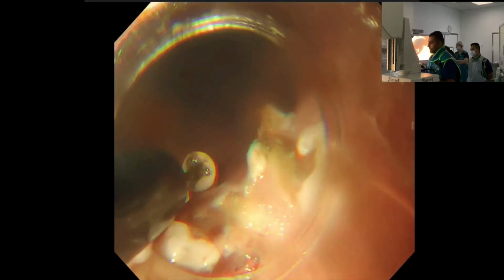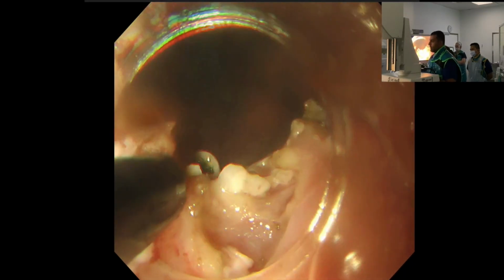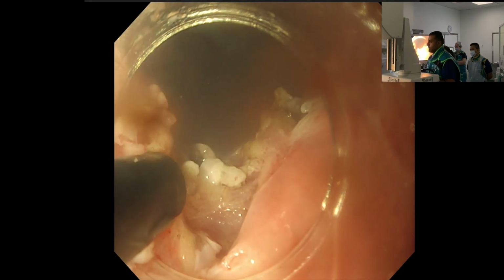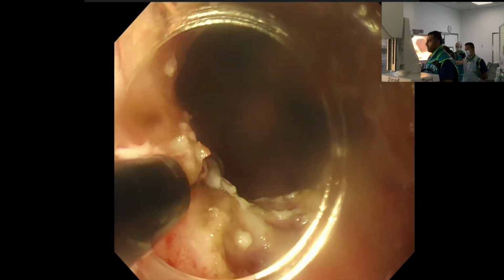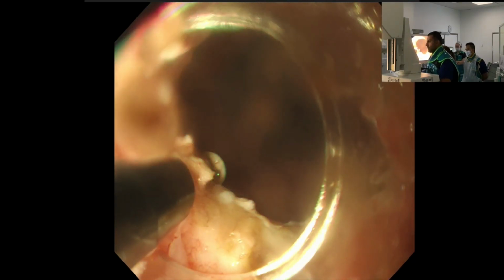You can see the muscle fibers underneath, so I probably don't want to go too much deeper here. Of course, operation, but I think that he will definitely benefit from one more session. So I'm going to shave off a bit more here.